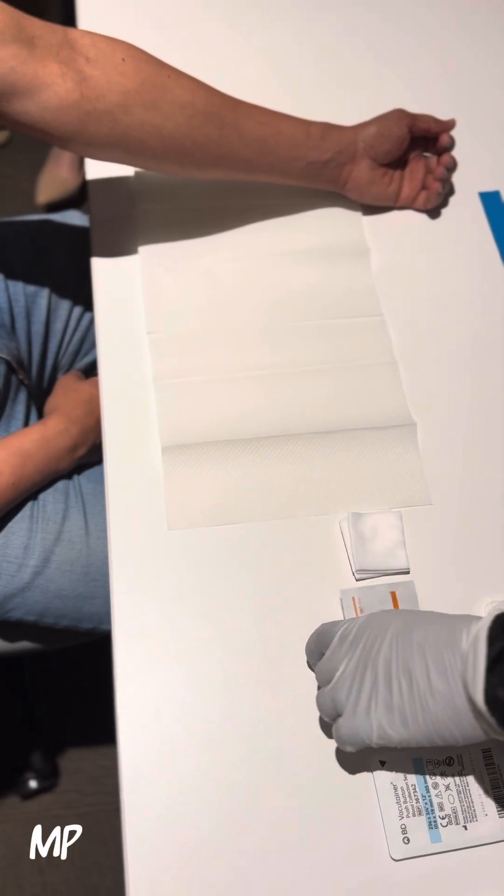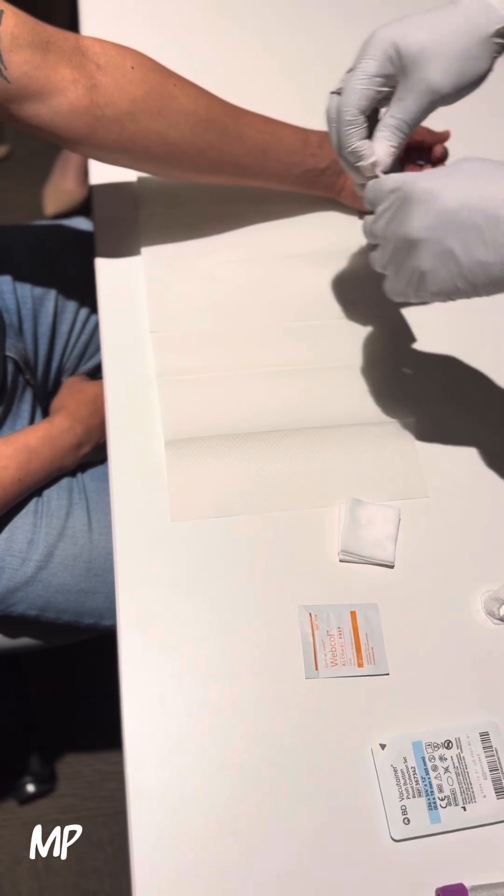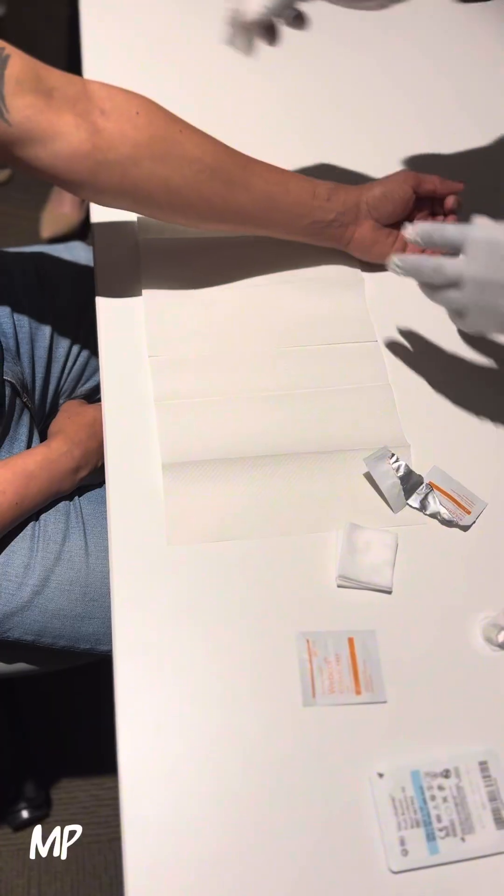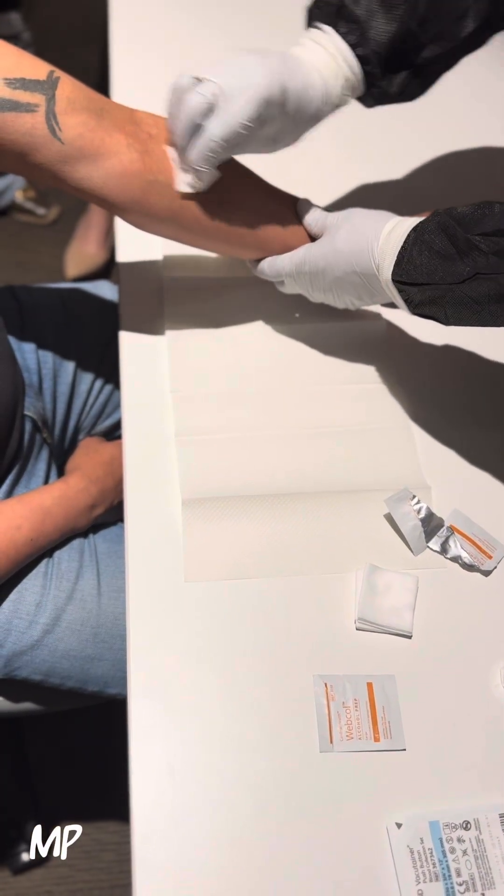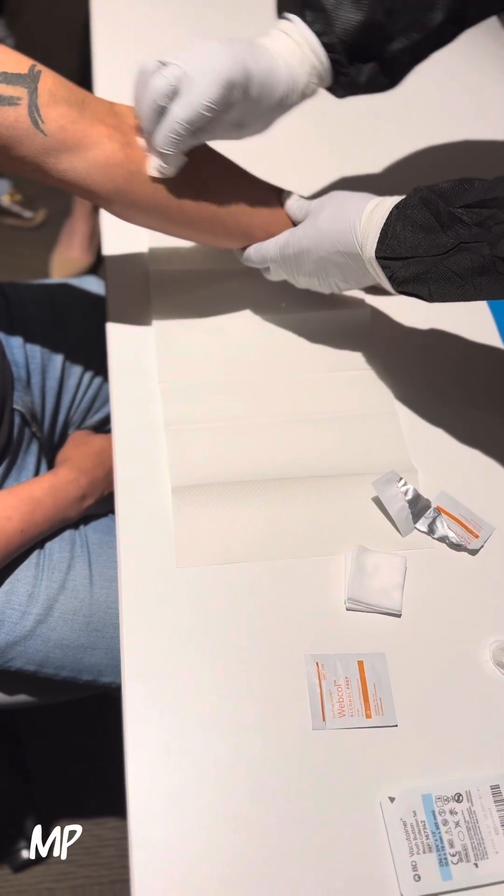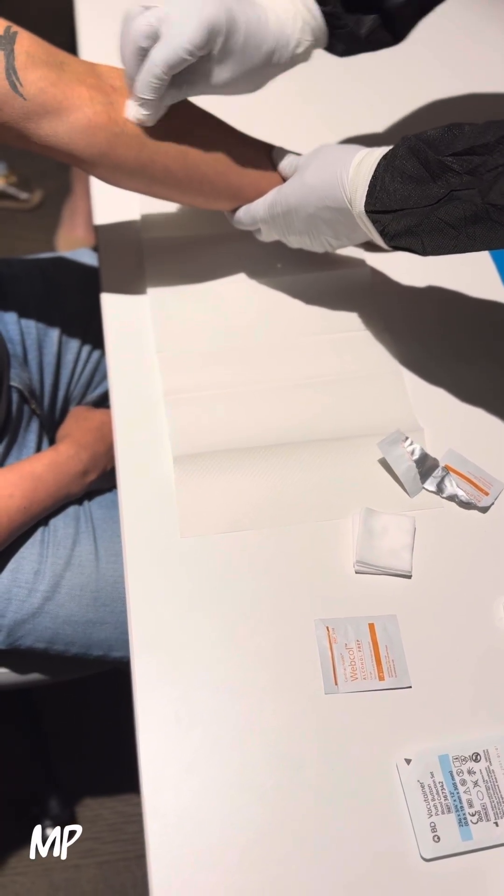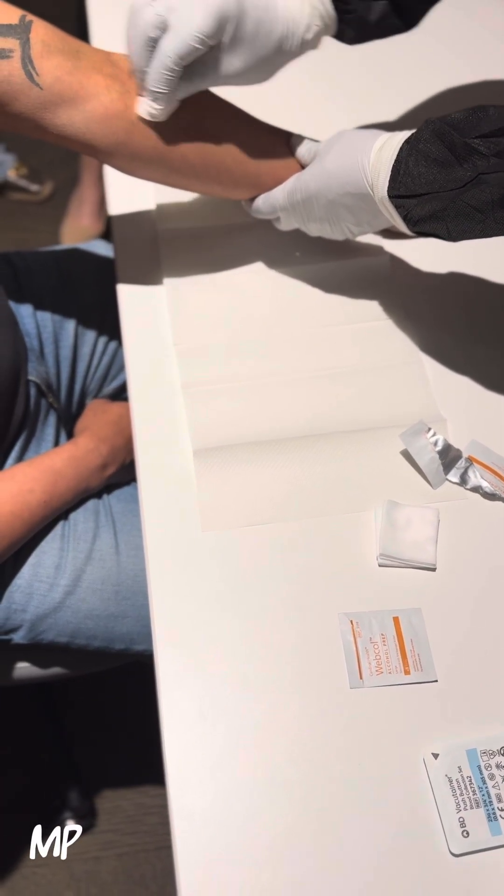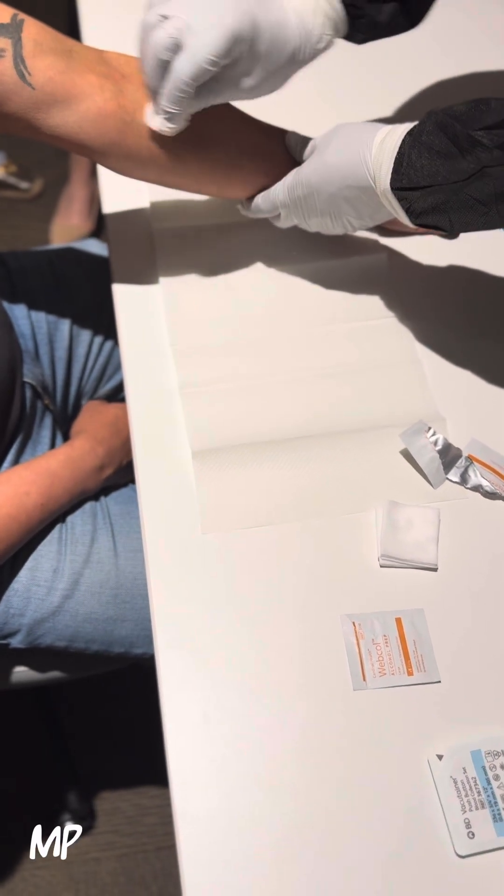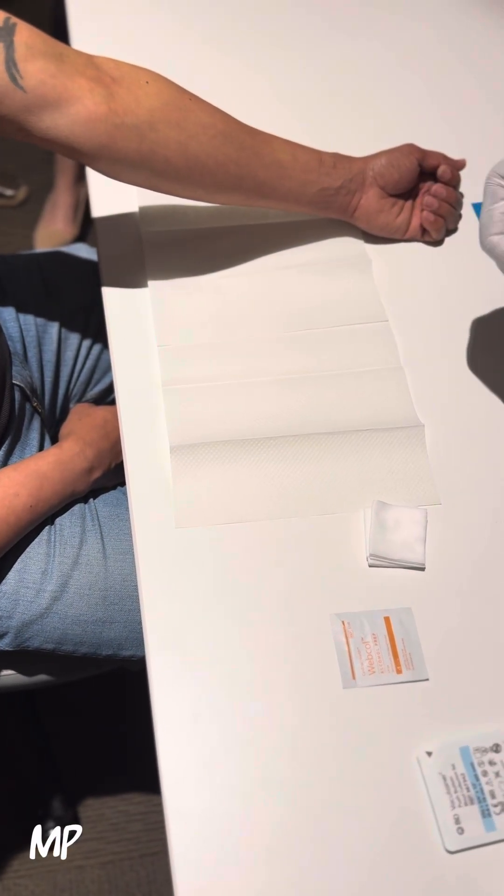Use the tourniquet. Clean the site with 70% alcohol, 20 seconds in concentric circles. Allow the site to dry.